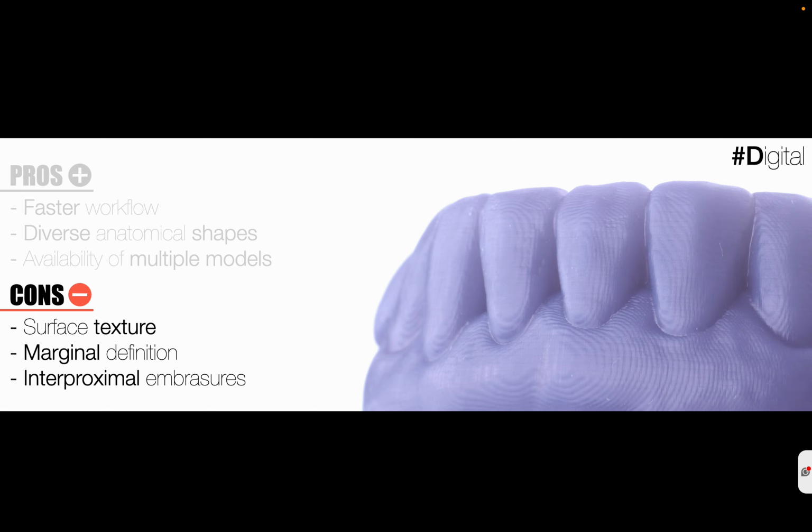As for the cons, there are some, and the main cons are due to the model: the texture of the model and the marginal definition of the model, which is related to the 3D printer and the 3D printing process. So in that part, we need to know that. But even with that, if I put in a balance that my pros are higher and better than my cons, I always try to choose the digital workflow.